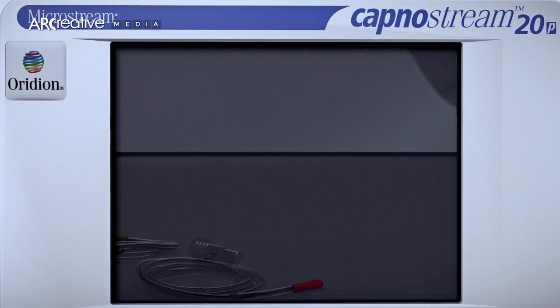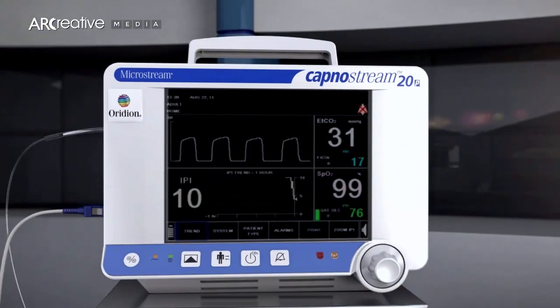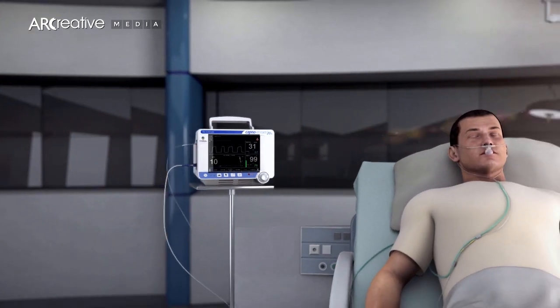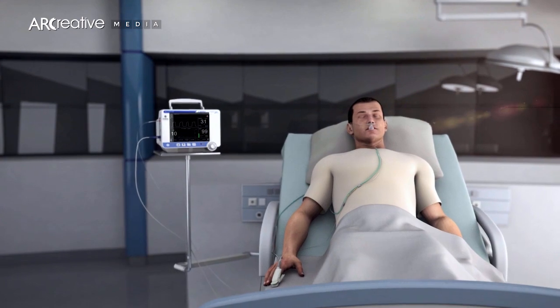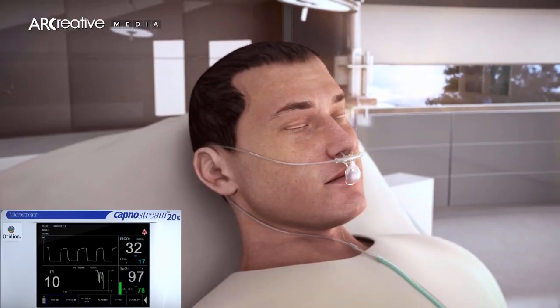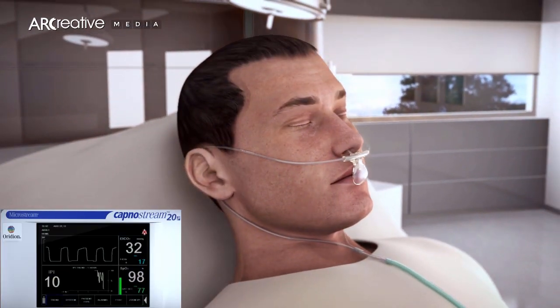To use the system simply turn on the patient monitor, attach the appropriate sampling line and begin monitoring with real-time end-tidal CO2 values, crisp waveforms and respiratory rates.